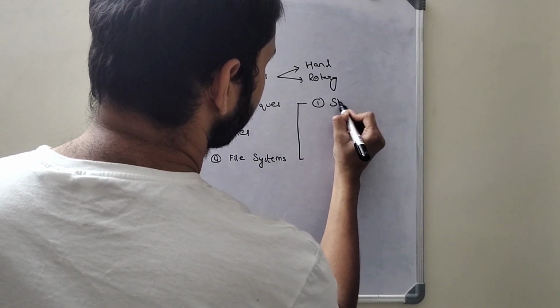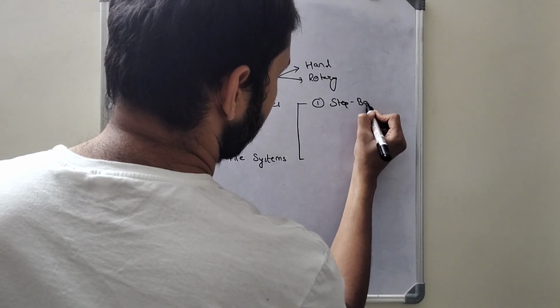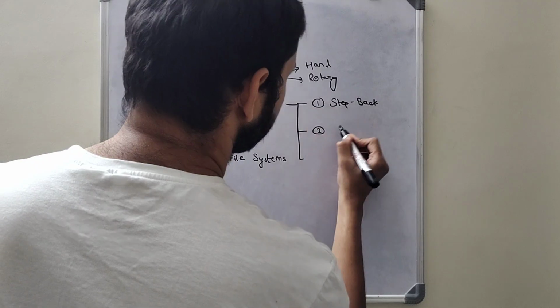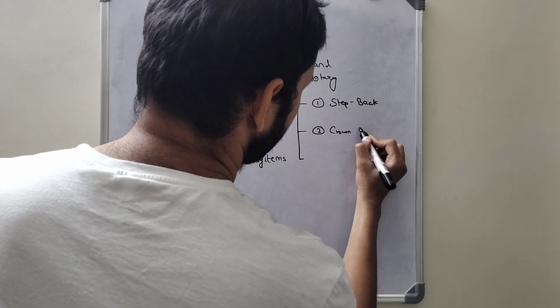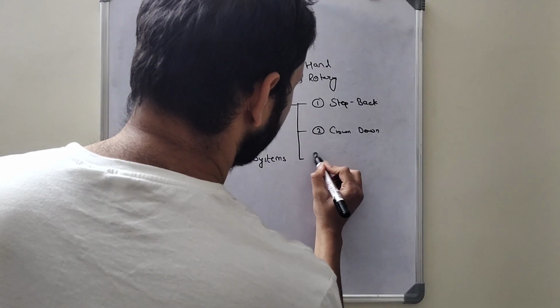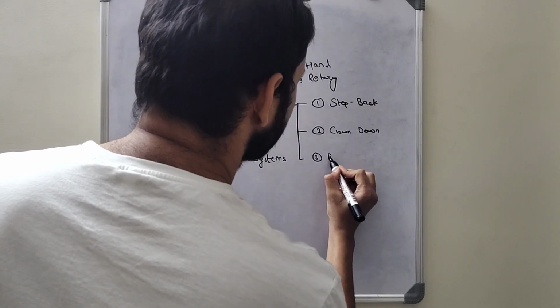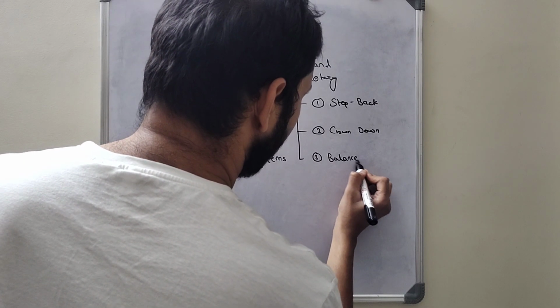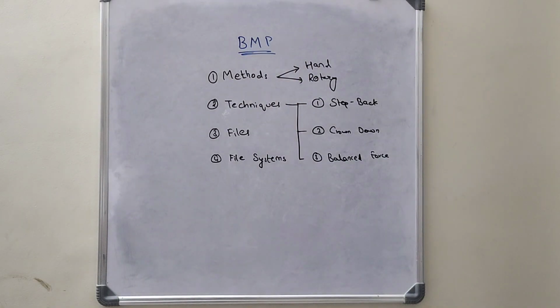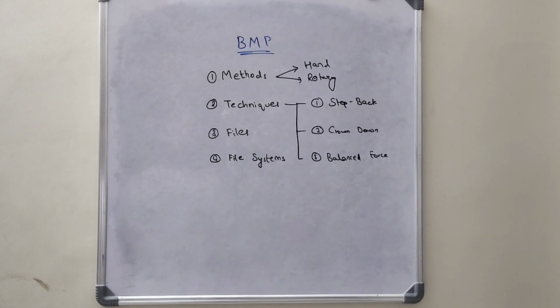One is your step back technique, the next one is your crown down technique, and the final one is your balanced force technique. These three techniques form the very basics of the BMP. We will continue learning about all these techniques in the further videos.